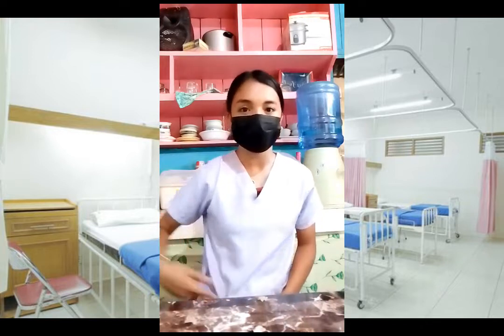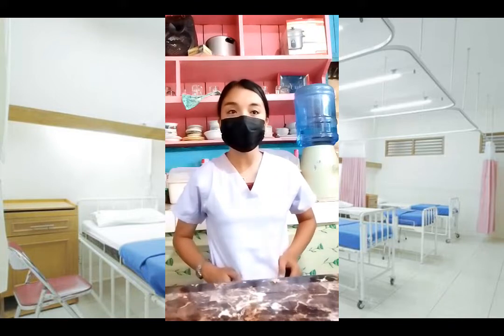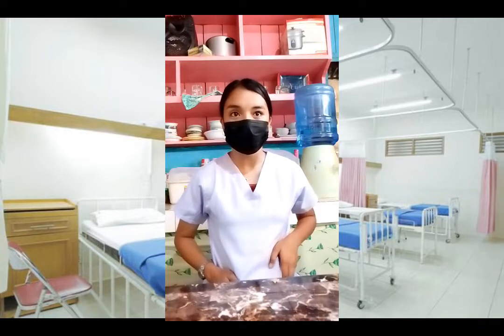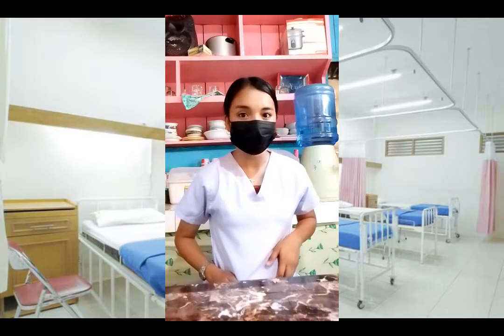For this video, I will demonstrate specimen collection. Its definition: a specimen is a sample of material taken from the patient's body for diagnosis and laboratory examination. Specimen collection means collecting a specimen.